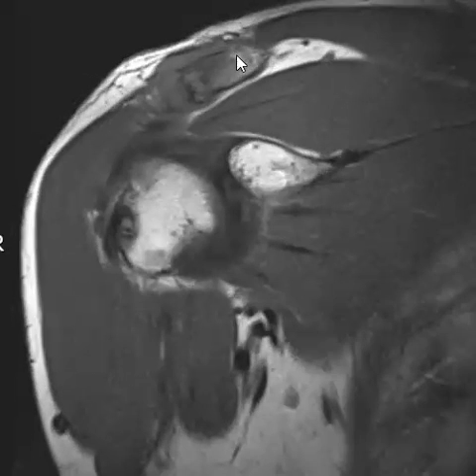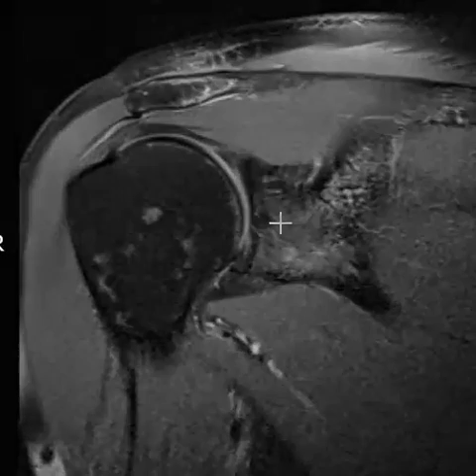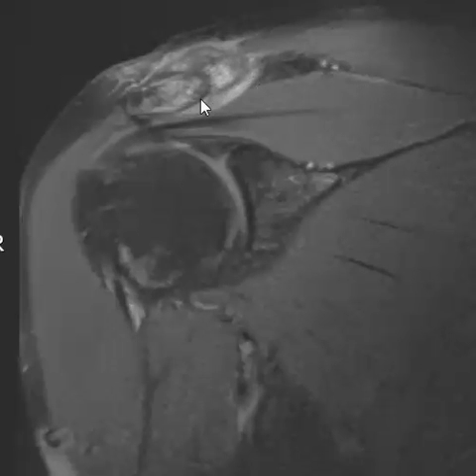We see really prominent edema within the distal clavicle. There's periosteal elevation — the joint capsule and periosteum are uplifted — and really prominent erosive changes in the distal clavicle. There's marrow edema in the acromion as well; it shows up well on the PD fat-sat sequence. Here we can see really light-bulb bright marrow edema, mostly in the clavicle but also acromion erosive changes, with periosteitis surrounding it, maybe pushing a little bit down on the rotator cuff below.